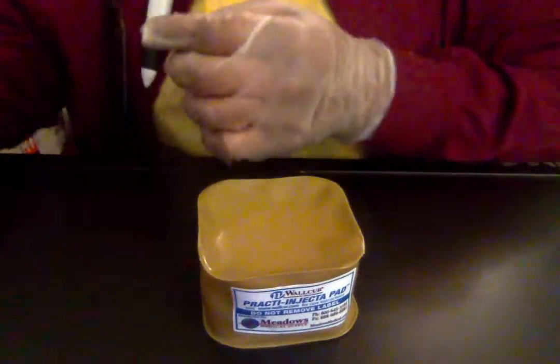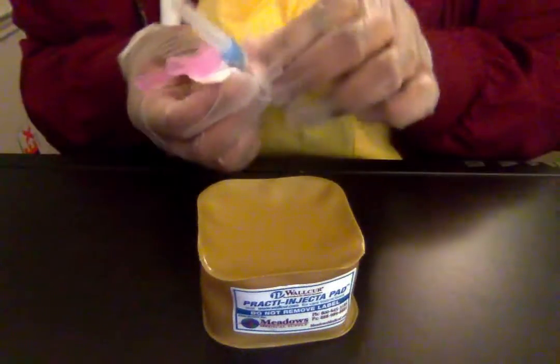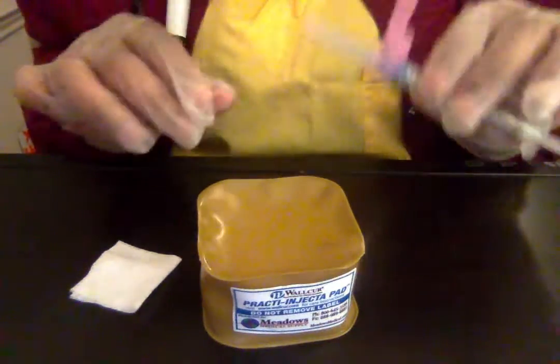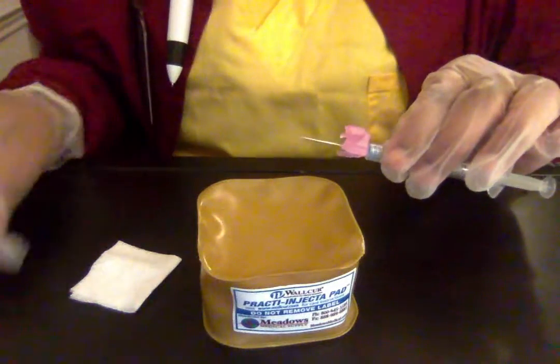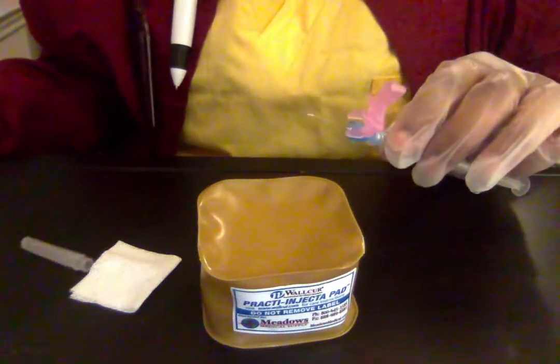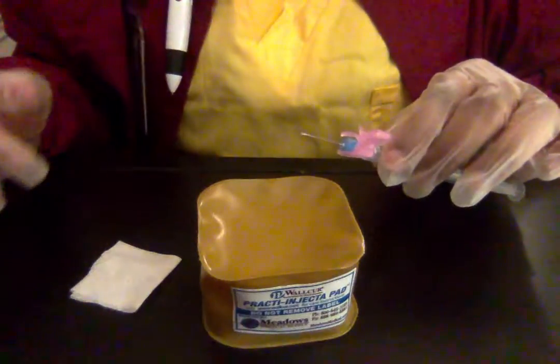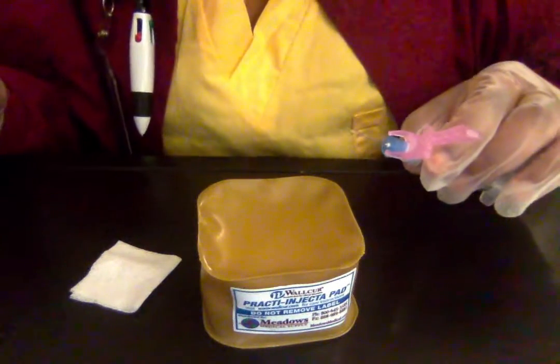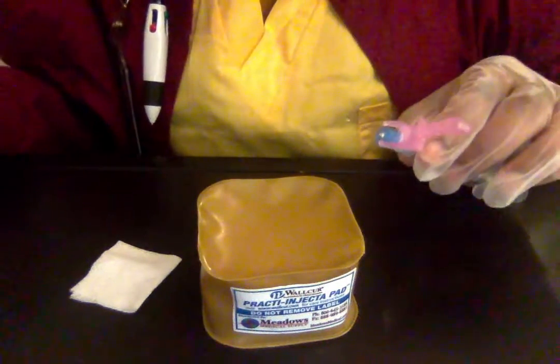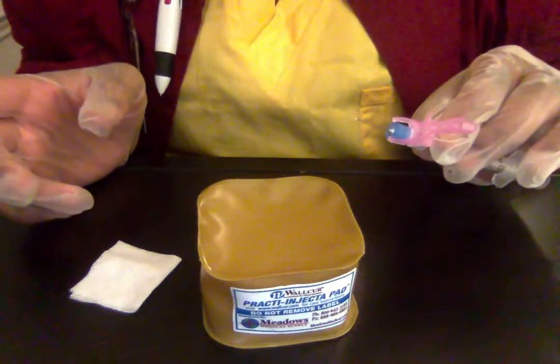Okay. And once I've got that, I will discard that part. Okay, so now I have my needle and I have my gauze. And for this, I'm going to go ahead and just take this off. And then for today, this syringe and needle is a 3 milliliter syringe with a 23 gauge and 1 inch, which are within range for what we want to use for our needle size and gauge for our IMs. So with the IM, we do go at a 90-degree angle.